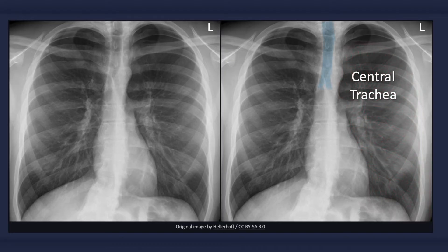As mentioned earlier, with a simple pneumothorax, the heart and mediastinal structures remain in their natural positions. For example, notice the central position of the trachea in this x-ray.